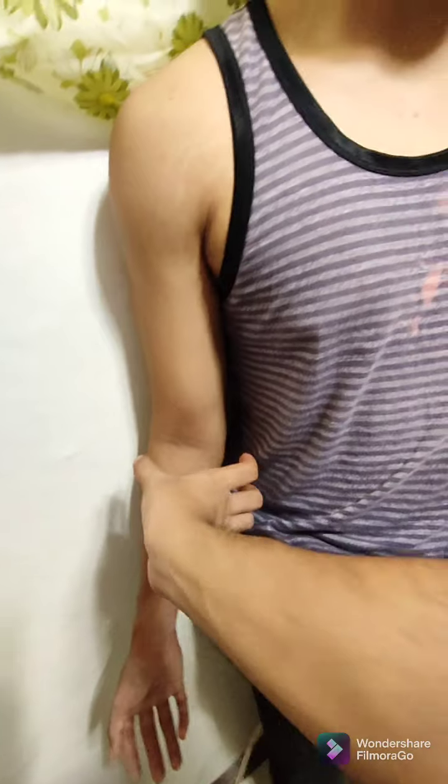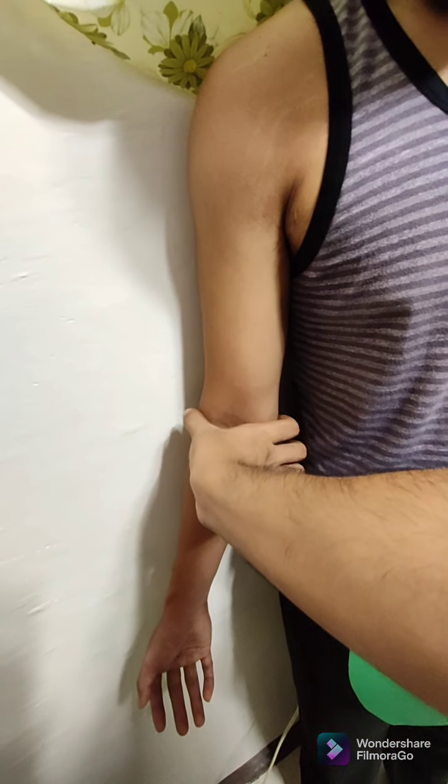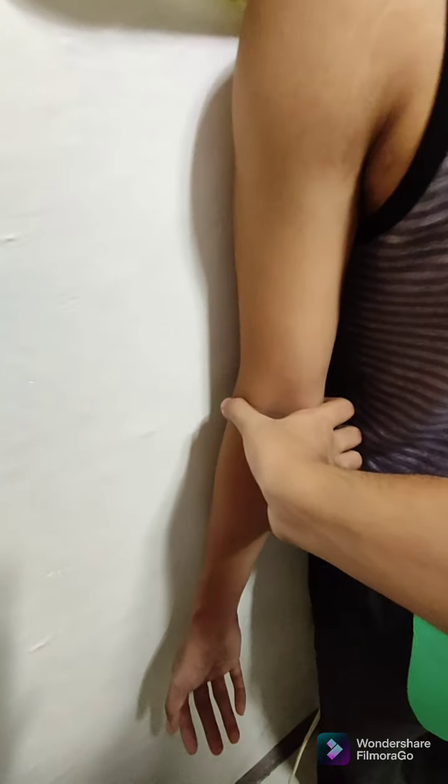To ensure na proper ang pag-rotate natin, make sure that this line, the epicondylar line of the humerus, is parallel against the IR. So, medyo rotated pa siya. Rotate ka dito banda, sir, pag ganyan. So, contact pa rin. Make sure also din pala ang kamay is abducted, meaning moving away from the midline of the body. Slight lang siya na abduction. So, parallel na siya. Aligned na siya sa IR.